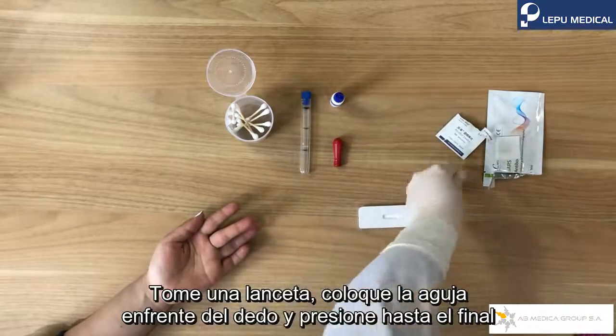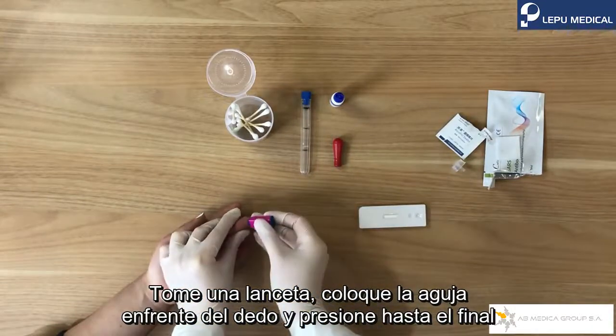Uncover the lancet, attach the needle side to the finger, and press to the end.